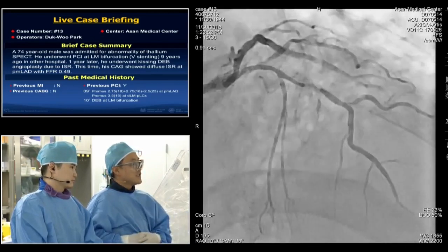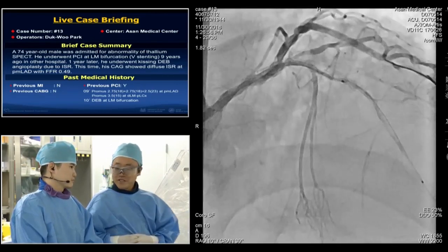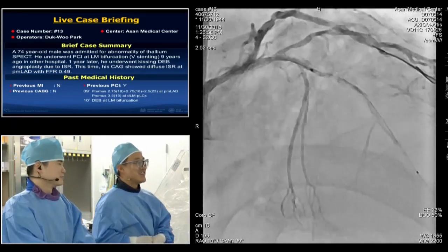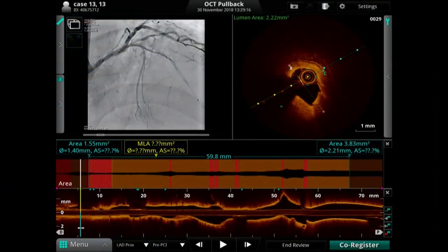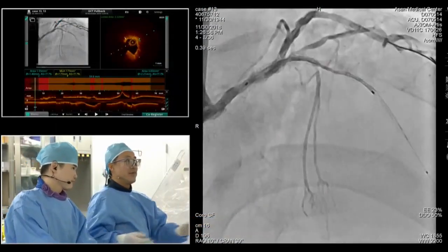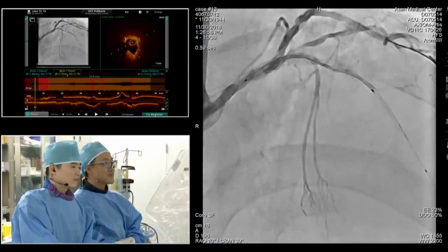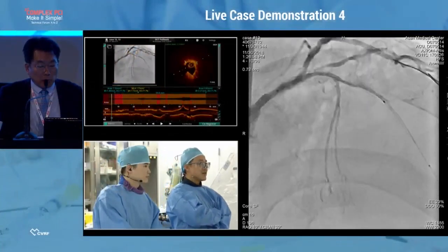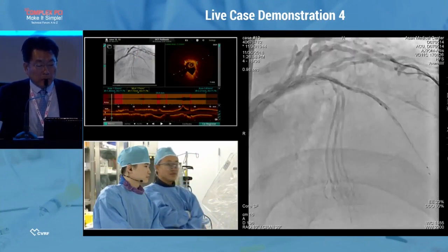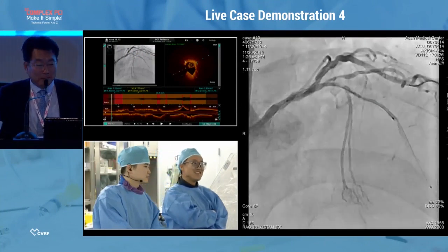So next, we decided this patient would have OCT-guided PCI because we invited an OCT specialist. We did the OCT registration and angiography co-registration, and thoroughly checked what was happening at the time, such as some under-expansion. We checked the OCT from the mid-LAD to the left main and the circumflex or left main. I think this case is one of the good candidates for our Roto ISR randomized study. What do you think? Would you do that? Yes, we consider it.